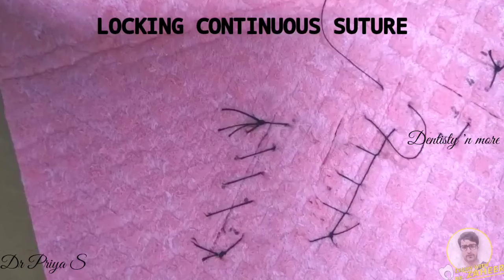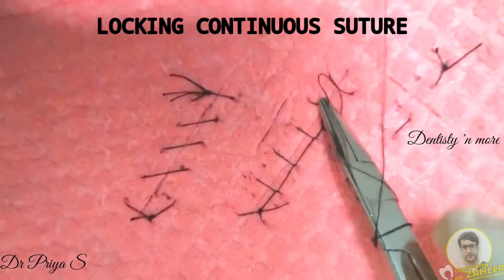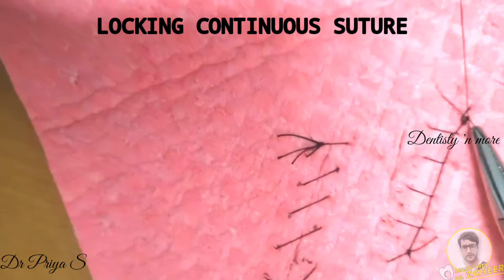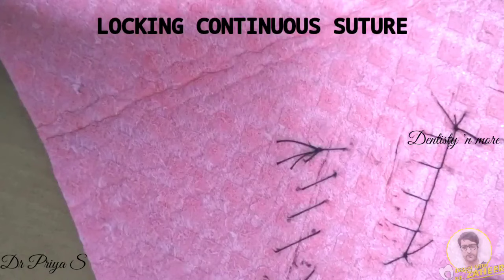Once you have sutured along the length of the incision and you take the final bite, do not pull the thread completely through the skin. Instead, make use of this loop to tie the final knot — same as you did for simple continuous suture. Then tie the suture, keeping a suture tag of 4 to 5 mm. So this is your completed locking continuous suture.